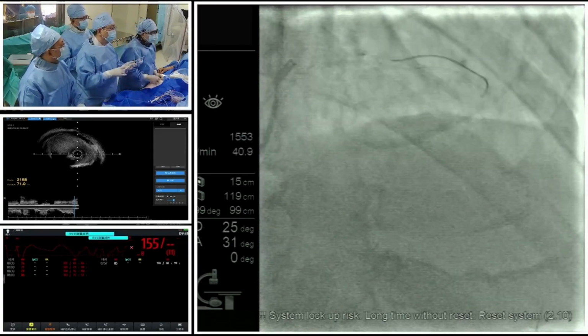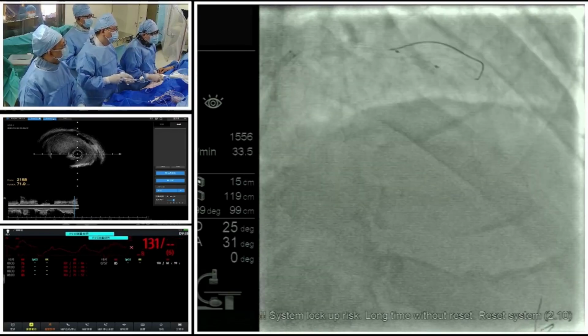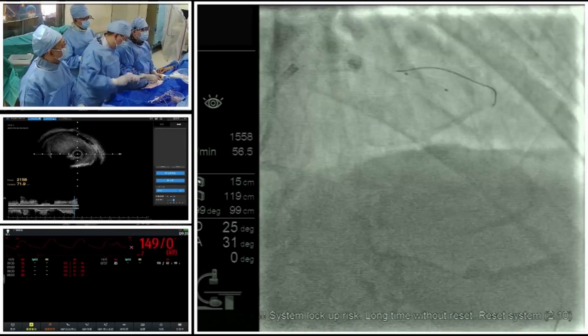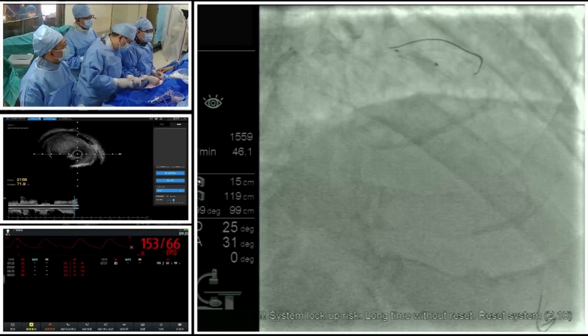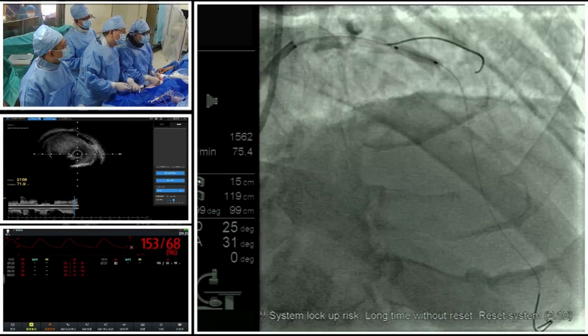When Dr. Zhang introduced the case, we did the QFR, we did the virtual stenting. So the virtual stenting gives you some general idea of how to put the stents. Do you think the virtual stenting is very useful? Yes.